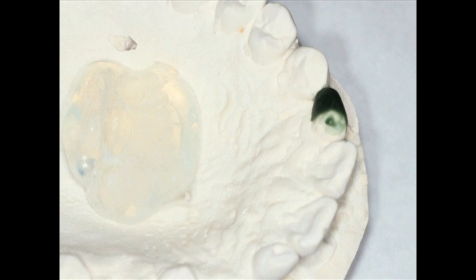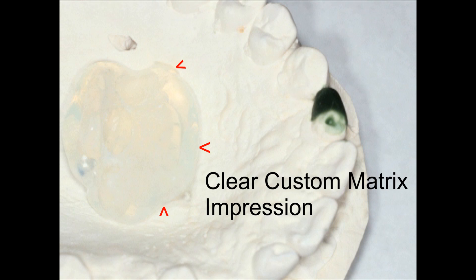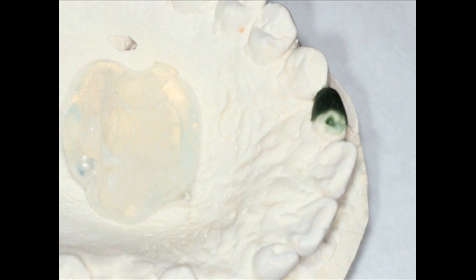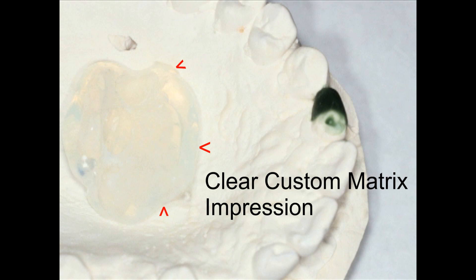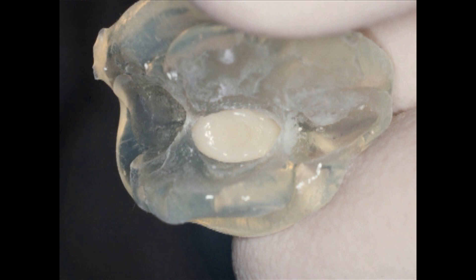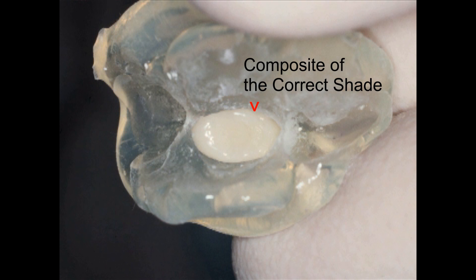We go ahead and make our custom matrix. When you make a large one covering three teeth, you want adjacent teeth to serve as indexes. I use an intraoral syringe tip to get all the embrasures around the tooth, then cut off the intraoral syringe tip and build up the entire custom matrix for the other teeth. It's very difficult to build up something this large through the small opening in the intraoral tip, so I use that for the fine details.